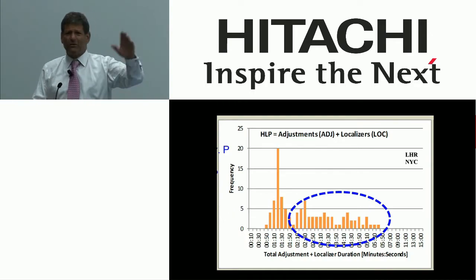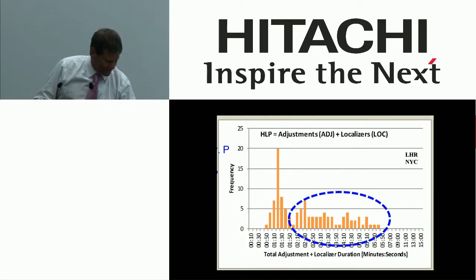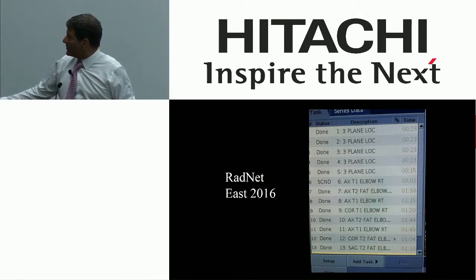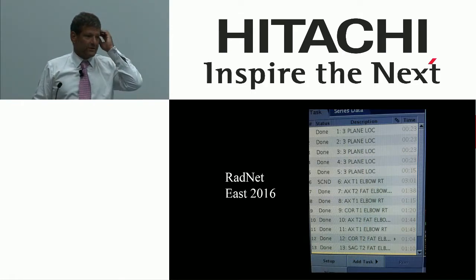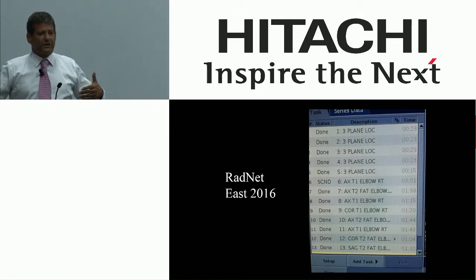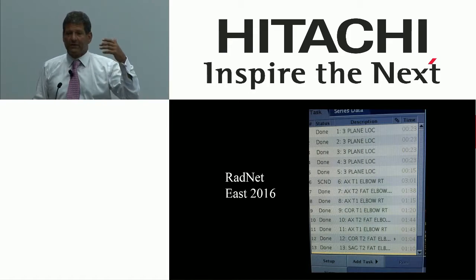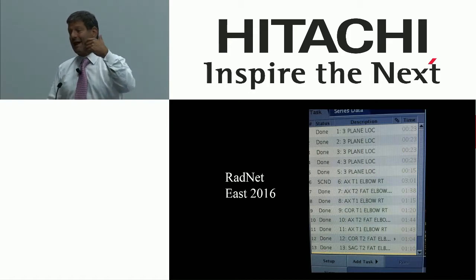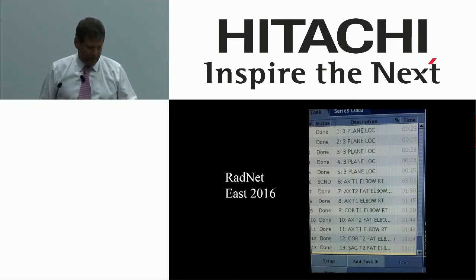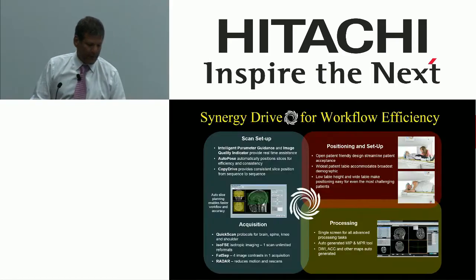Now, who's ever done 5 minutes? Nobody's done that, right? Well, take a look at this. Right off a brand new 3T scanner, 1, 2, 3, 4, 5 localizers. It's an elbow. We didn't know where it was. It's a knee in a funny position. Whatever it is, it happens. I see 2 commonly. I see 3 not infrequently. And I walked up and watched this live. 5 localizers. That's not the way to go. That does not contribute to diagnosis. That does not contribute to patient care.